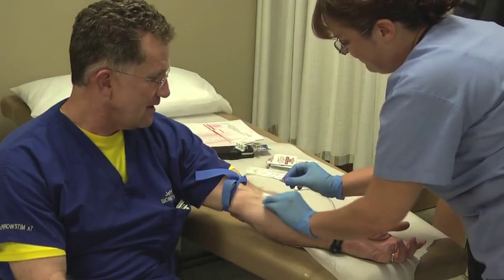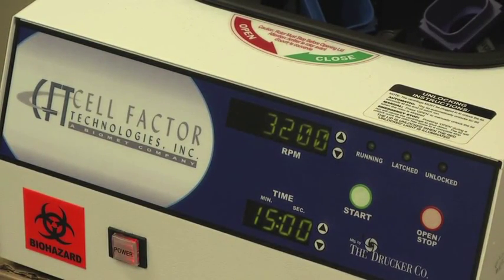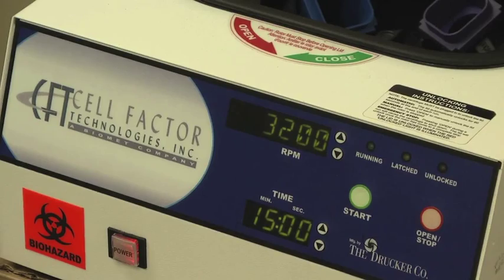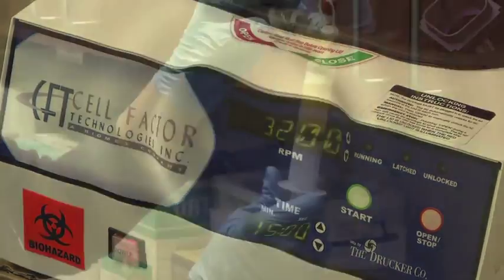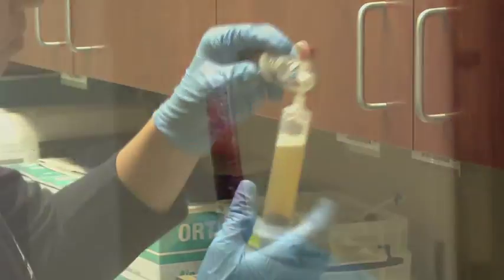The first step is to draw the patient's own blood. We then place it into a centrifuge so we can spin it out and get the different components from the blood. Here we're removing the serum so that we can isolate the PRP. Now you can see in the tube our platelet-rich plasma.